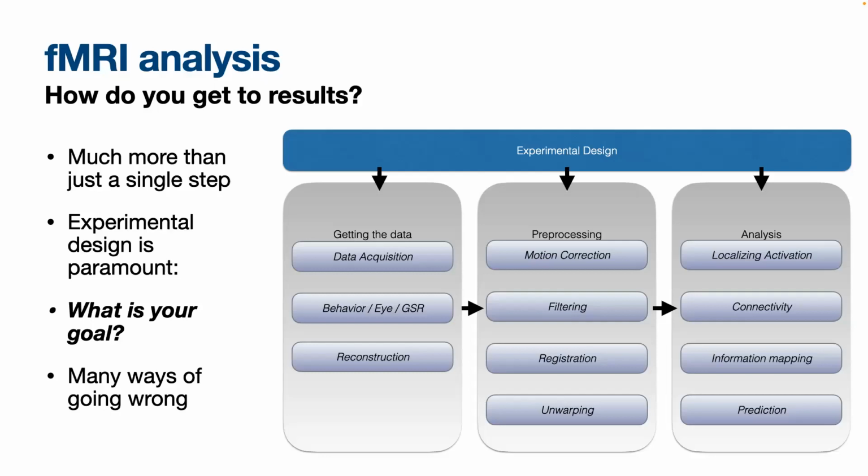So you want to be very careful about how you acquire data, right? Put people in the scanner in the right way, choose the sequences that you use, and the different scans that you make, in exactly the right way. They have to be targeted in exactly the right way. If you are interested in something that's going really fast, you shouldn't use really small voxels because they take a long time to scan, for example, right? You shouldn't accidentally only scan the frontal lobe if you're interested in the visual system, which is at the back of the brain. So there are all these choices that you make. That was a bit silly, but you get the point.